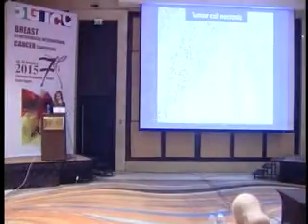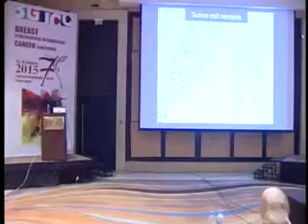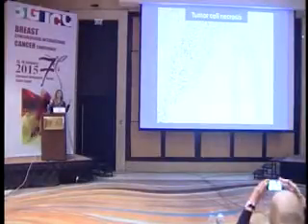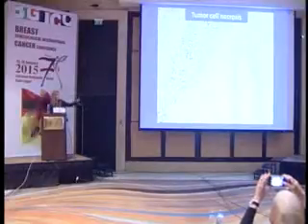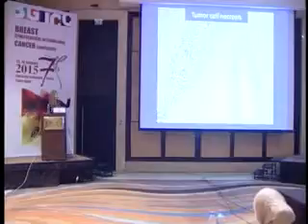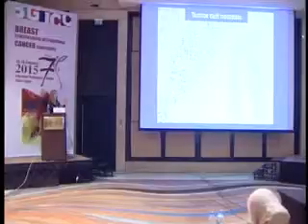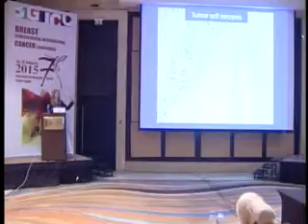And let me show you a few slides. It has to be tumor necrosis. In the tumor necrosis, usually around the vessels there are viable malignant cells. Okay, it's spared. If you think about the hyalinization, it's very confusing, but it takes over everything. It takes over even the vessels. But the tumor necrosis spares the cells around the vessels. And it has a sharp demarcation, as if you can draw a line here. There is no transition, okay?